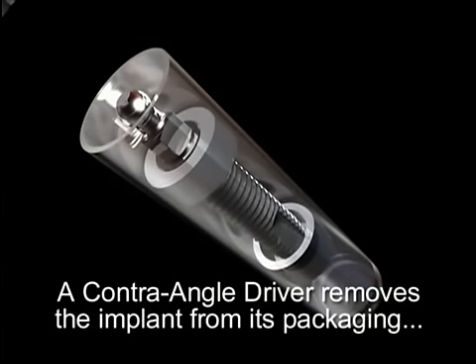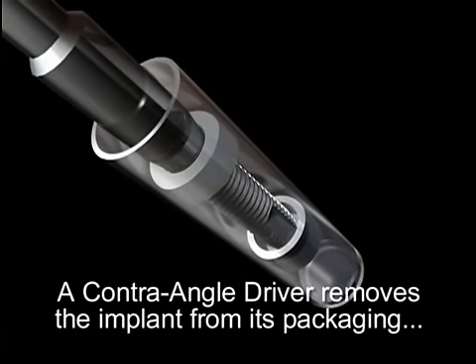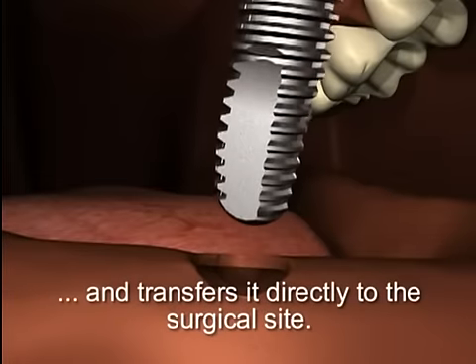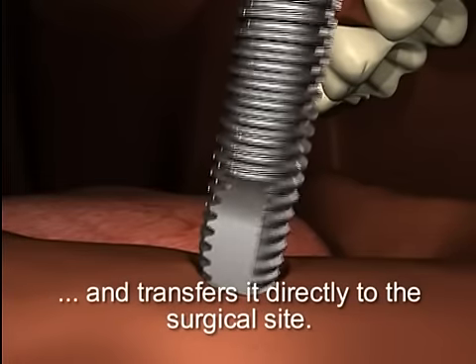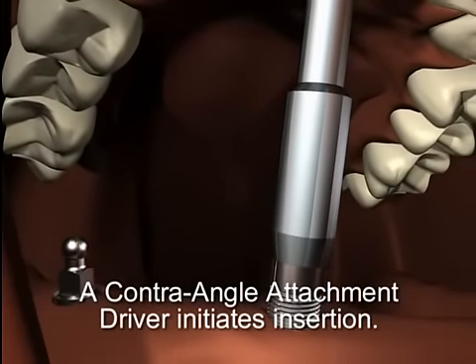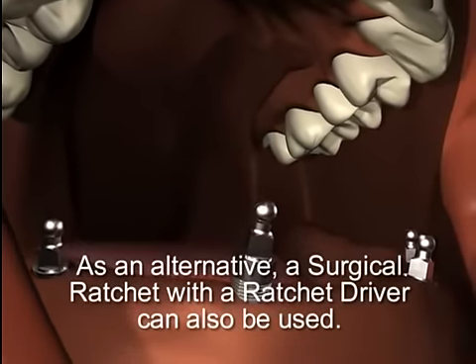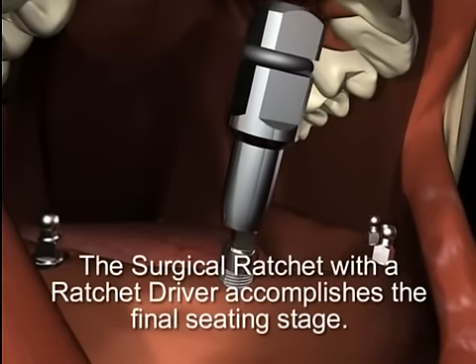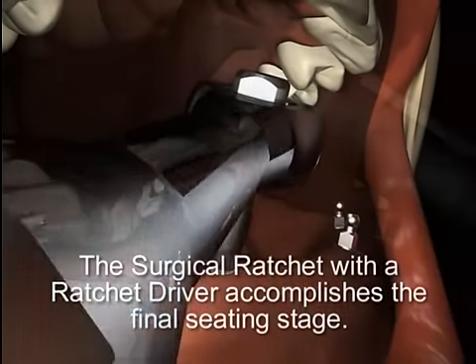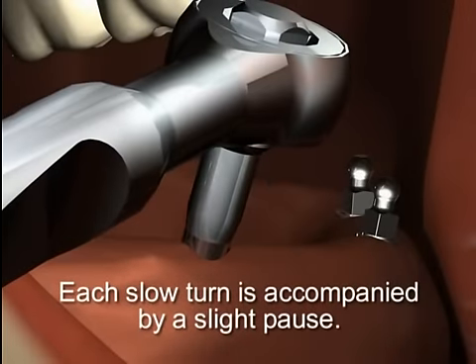A contra-angle driver attached to a slow-speed handpiece slips over the O-ball to remove the implant from its sterile packaging and transfers it directly to the surgical site for seating. 15 RPM or less initiates insertion. A surgical ratchet with a ratchet driver can be used as an alternative. The final seating stage is accomplished using a surgical ratchet with a ratchet driver. Each turn is accompanied by a slight pause.